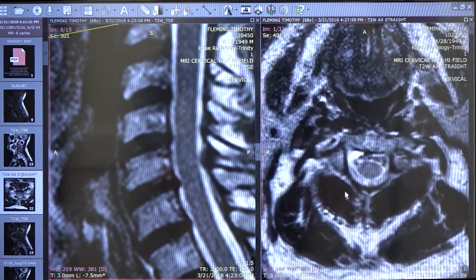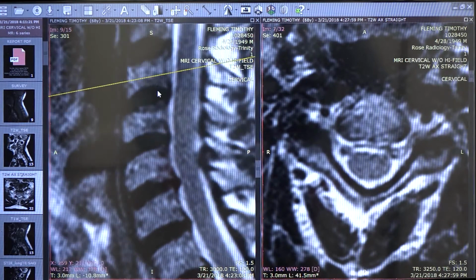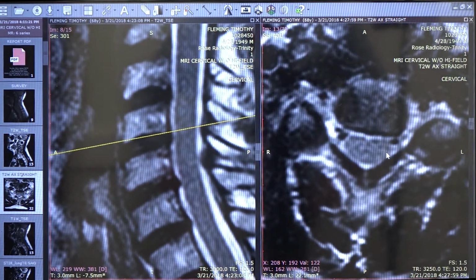When we look at the axial images and bring them down to the 3-4 level first, you will notice that he does have a very minimal compression, but there's pretty good open nerve foramina here on the left. The one on the right is a little bit narrow. Maybe some headaches may come of that. Going down to the 4-5 level, the gentle disc herniation has a little more preponderance to the left side. Open space, the nerve foramina on the right. On the left, he has a little bit of a narrowing, as you can clearly see.